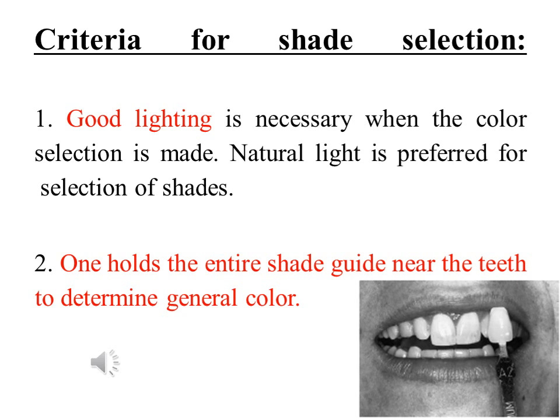How do we select the shade? Number 1, we must have good lighting. Number 2, hold the entire shade guide near the teeth to determine the general color.